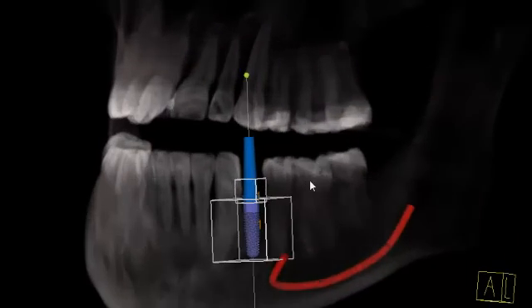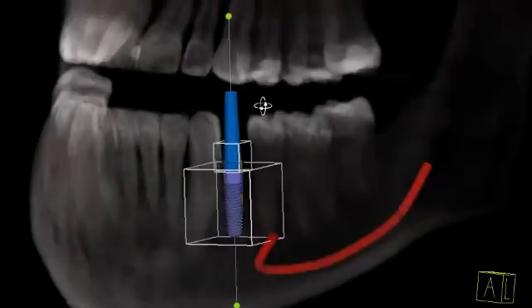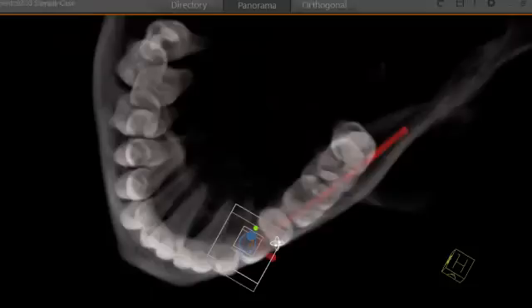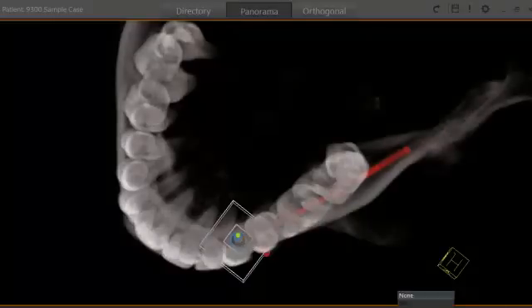And of course we can always reference our planning in 3D — this is useful for showing the patient.